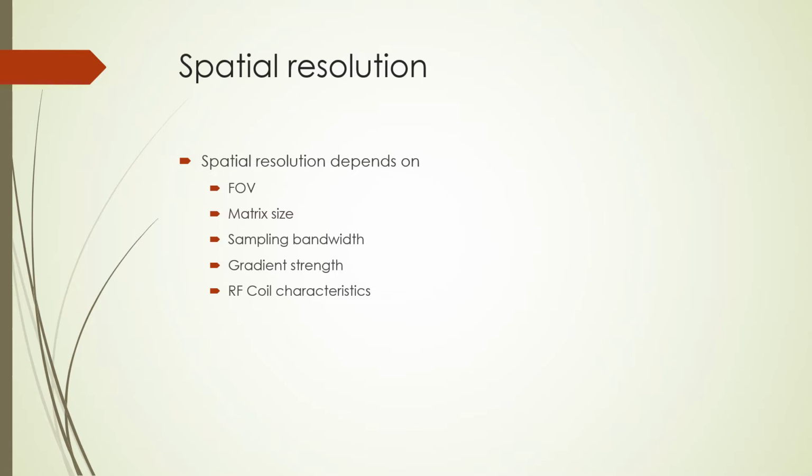Spatial resolution can be improved with higher field strength magnets due to higher signal to noise ratio, which means we can use higher sampling rates and thinner slices for a given acquisition, but at the expense of longer T1 relaxation leading to reduced T1 contrast. There is also increased RF absorption and artifacts.